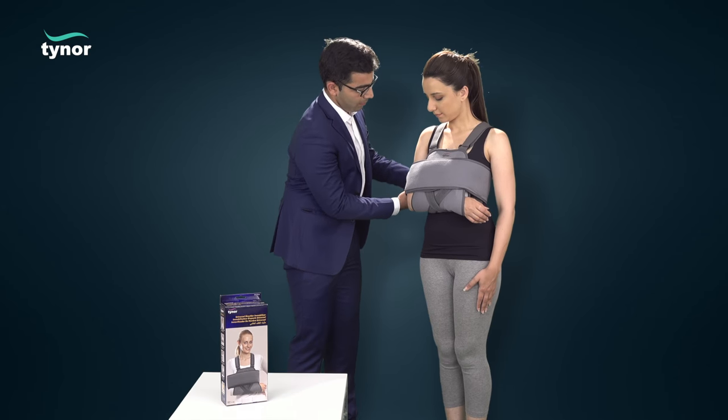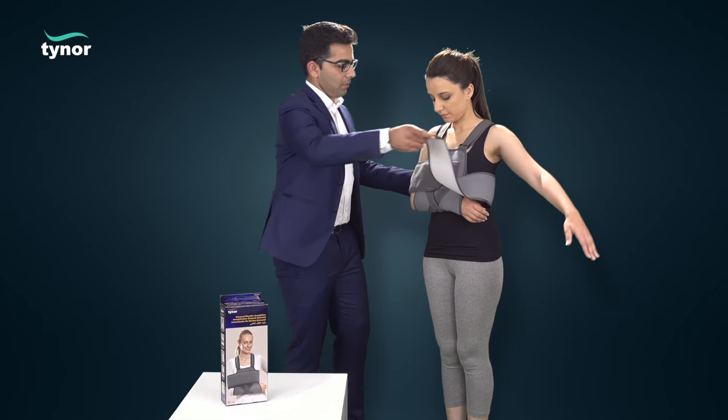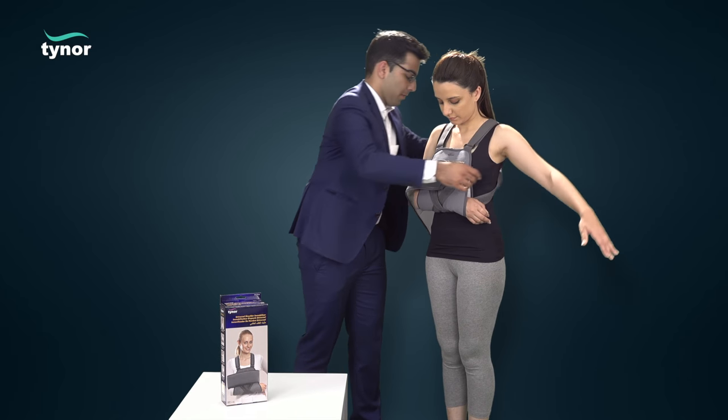Now let us see how to remove the universal shoulder immobilizer. Unfasten the hook loop of the arm restraint band and then the shoulder strap hook loops to easily remove the product.